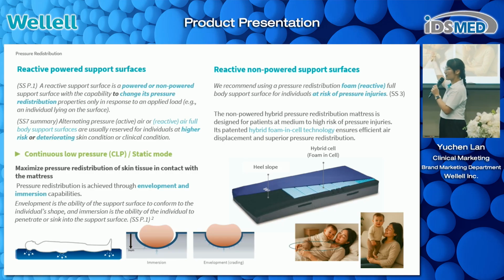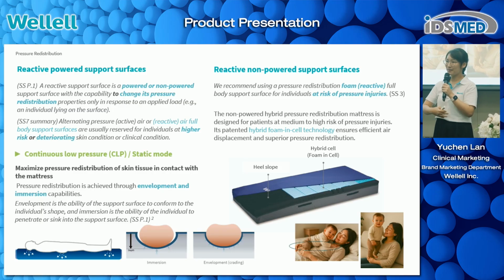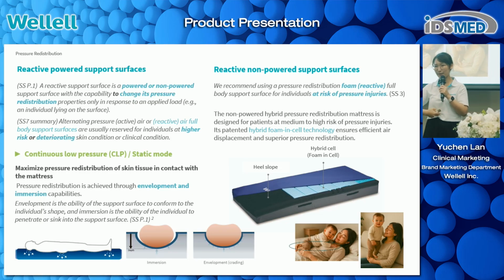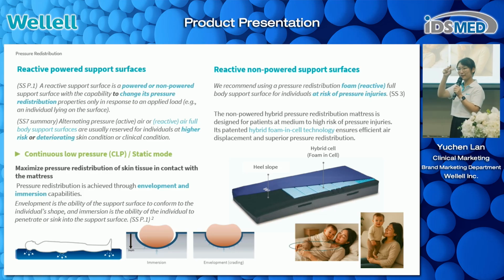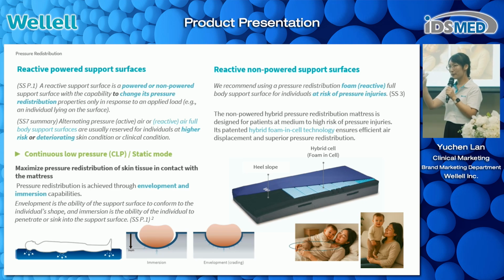When we are holding a baby, there are lots of contact areas with the baby, right? So we will feel warm and comfortable. However, everyone has some experience of a baby stepping on your belly, right? The same force, the same body weight of the baby, but the contact area is only their little cute feet. So it will cause more pressure.